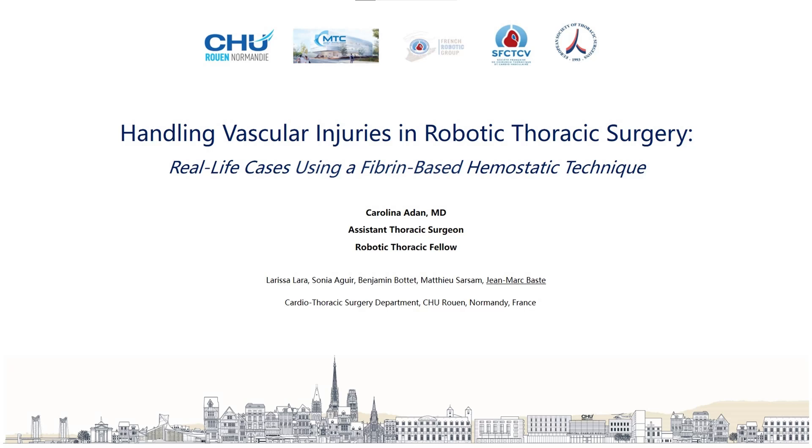Handling vascular injuries in robotic thoracic surgery: real-life cases using a fibrin-based hemostatic technique.